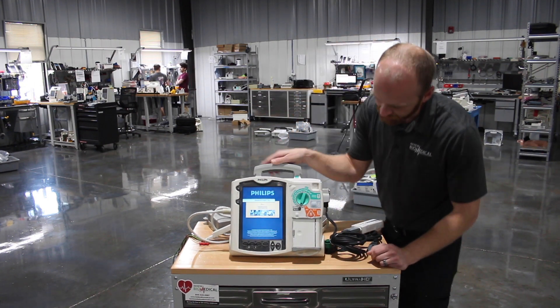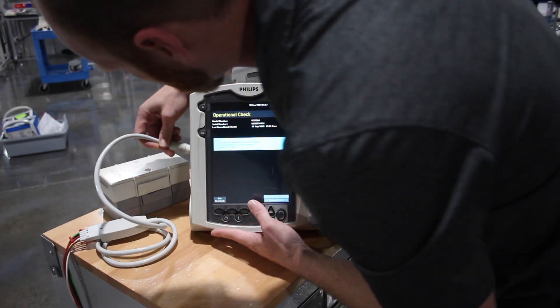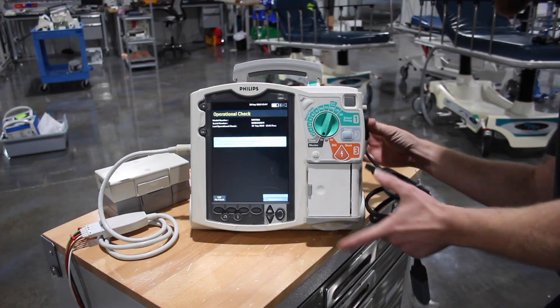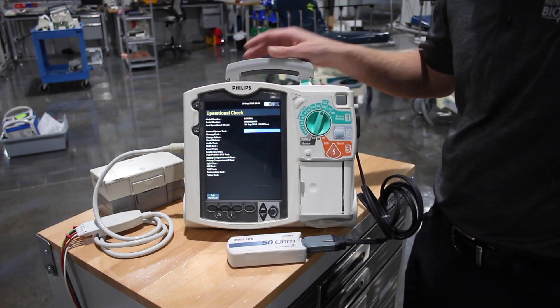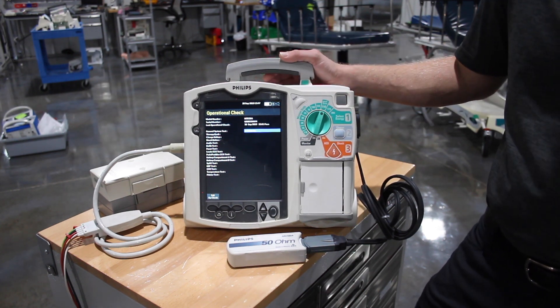Go ahead and run an operations check. From here it's going to instruct you to connect your ECG cable, plug in your therapy cable along with the test load, and then set your unit to 150 joules. It's basically going to run the whole test by itself minus a charge and a shock when instructed to do so.